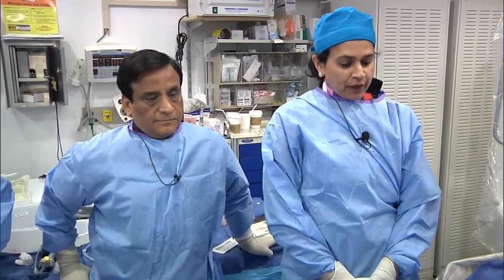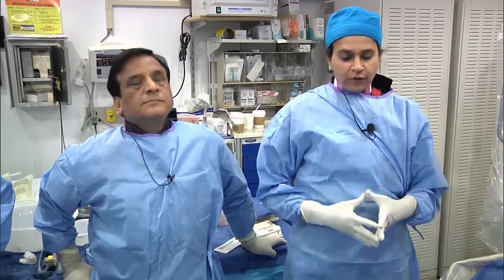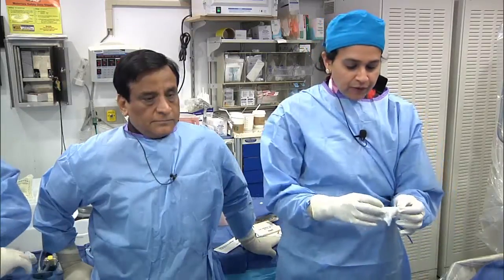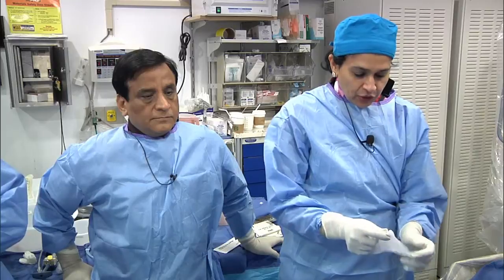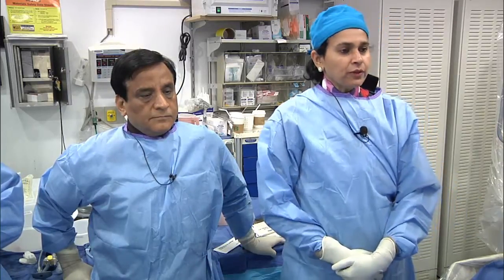Definitely, I would prefer Fielder, not a Fielder XT or Whisper. You know, it's whatever wire that you are comfortable with. No matter which operator, everybody has their favorite wire, their favorite devices. Certain wire, it just feels that the wire listens to your finger. So I would have gone back with the Fielder to see that.